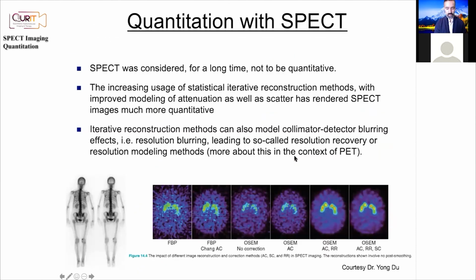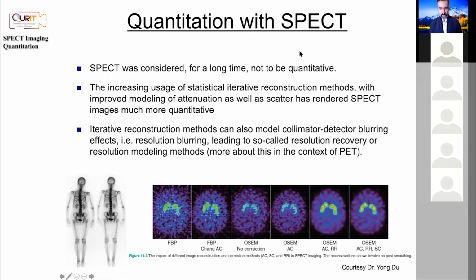So that's it. If next time somebody tells you SPECT is not quantitative, you can say, maybe not on your scanner, but it can become quantitative. And hopefully we will all be moving towards an area where SPECT is being done routinely in a quantitative manner. So thank you very much.